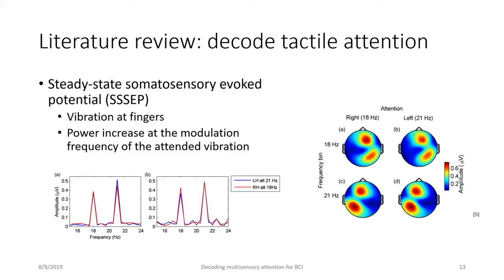So on the other hand, if we use tactile, the vibration, as the stimuli, what would happen? There was a study when they applied a vibration at the fingers of the subjects. They were holding this vibrator in their hand, and the vibrators were vibrating at different frequencies, and they were instructed to pay attention to either left or right.